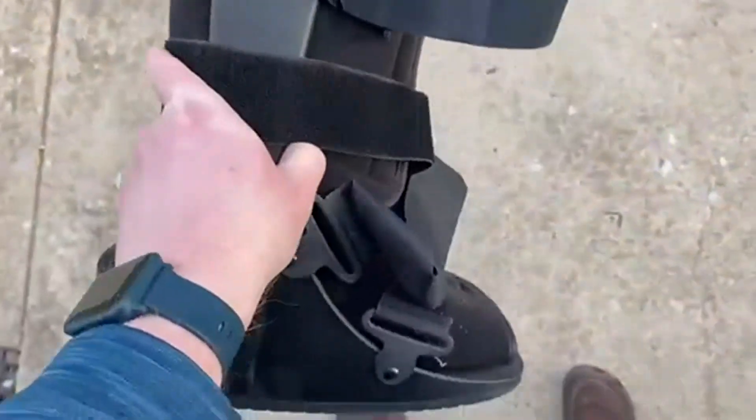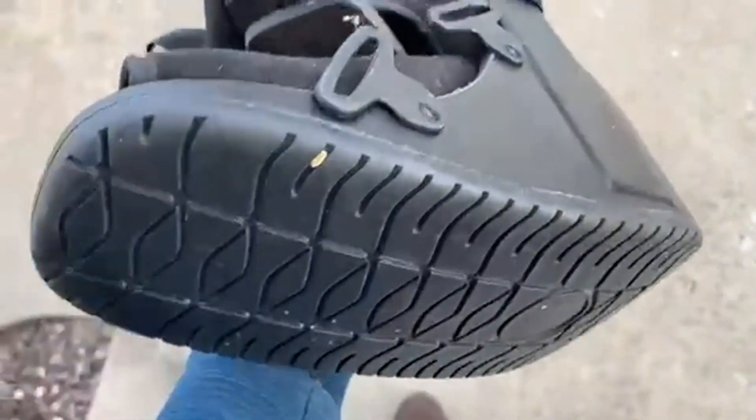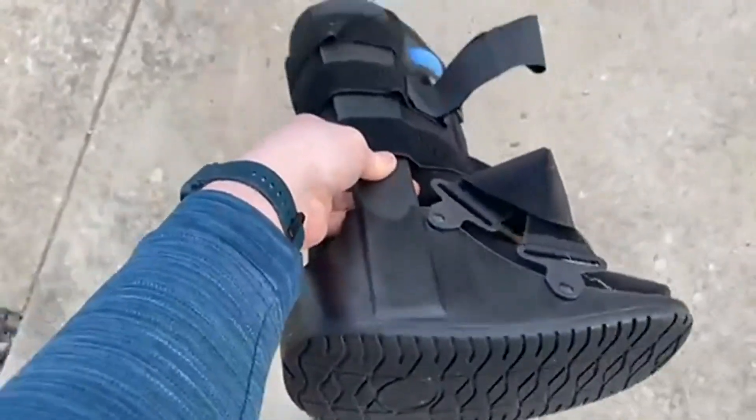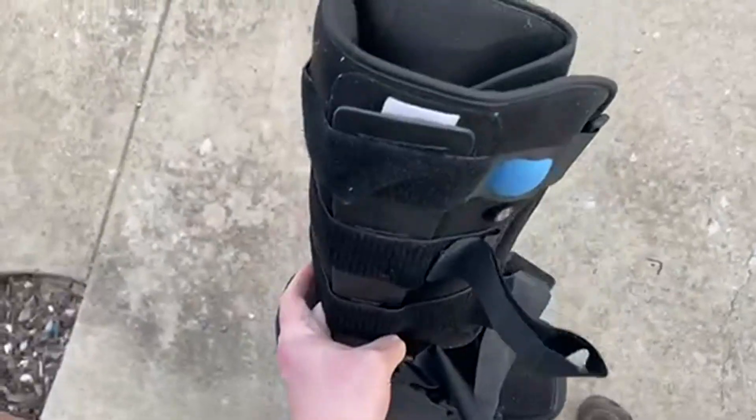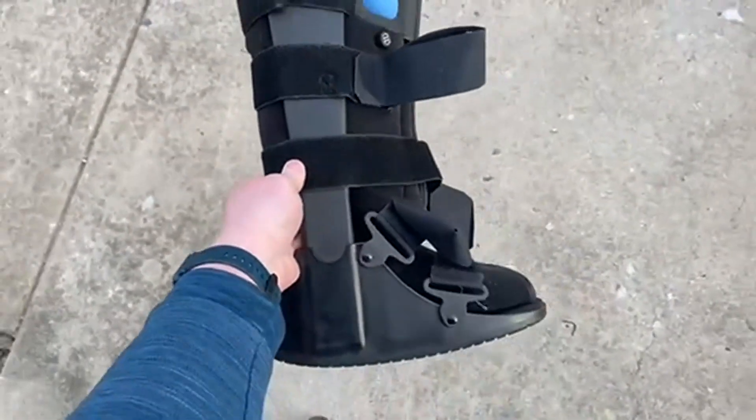The splint on the side of it is just super solid. And again, you need something that's got a nice sturdy tread on the bottom of it, and this certainly has that. You can go check it out — it's got a nice blue pump on it for comfort.